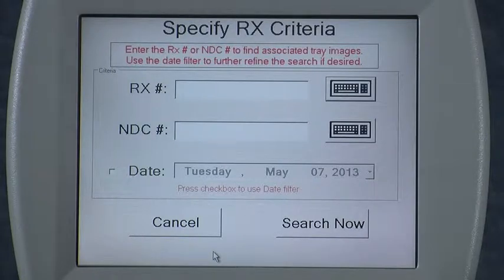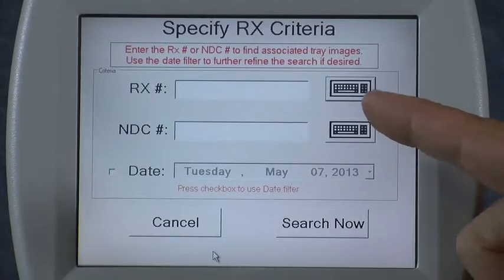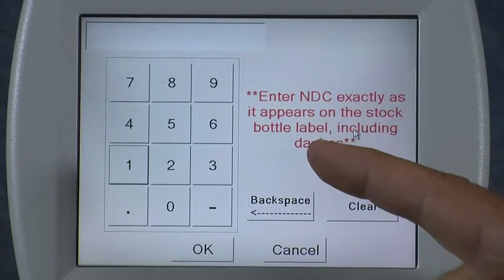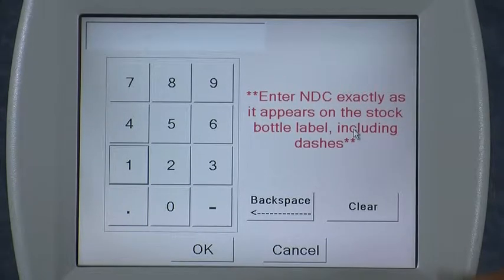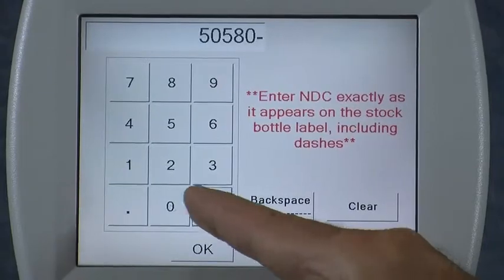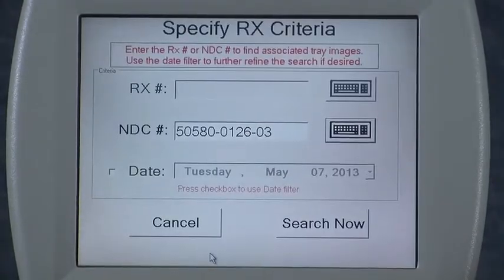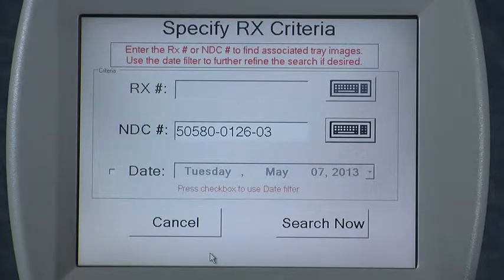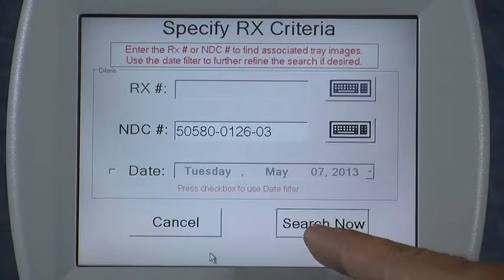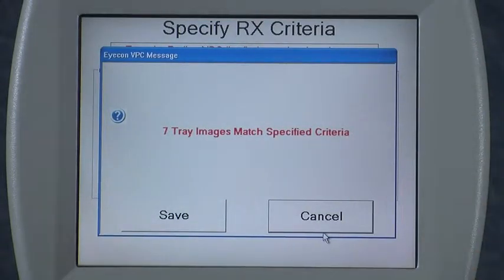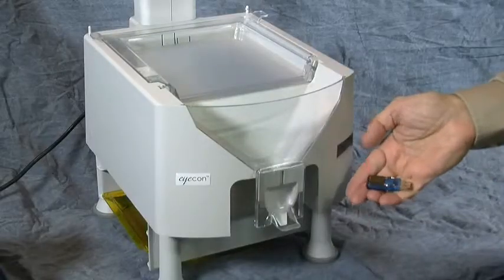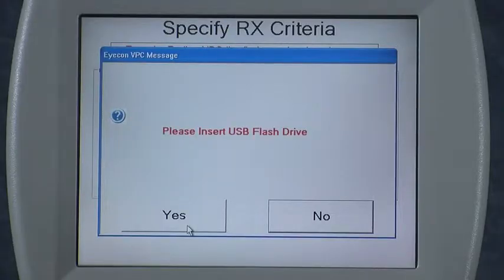If you are not using the icon in validation mode, then the icon is not aware of the prescription numbers. Therefore you'd need to key in an NDC number to search for specifically. Select the keypad icon and then key in the NDC number — the one I'm going to search for is 50580-012603, and hit OK. If you wanted to search for a specific date you can, since with an NDC number you're probably going to have a large number of prescriptions for that particular NDC. I'm going to hit search now and it says it found seven tray images for that particular NDC. If I press save, it saves them to a special folder on the icon so you can access just those photos that match that NDC, and I can access them over my network connection.